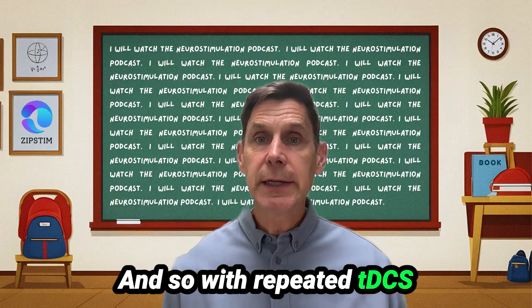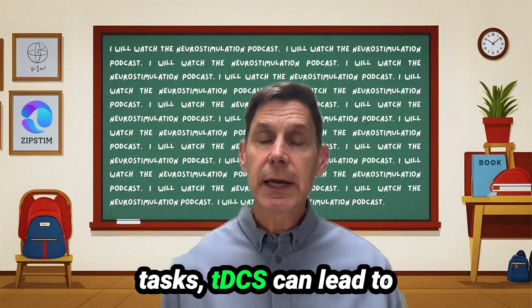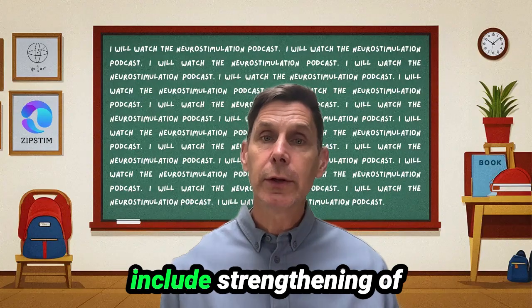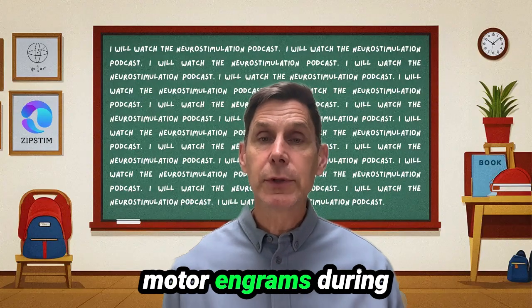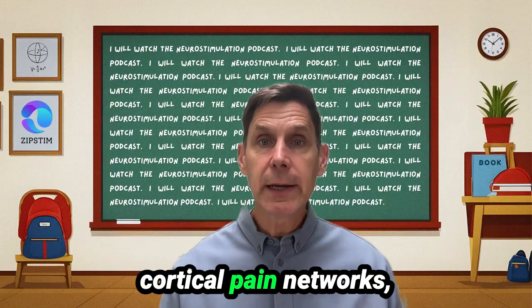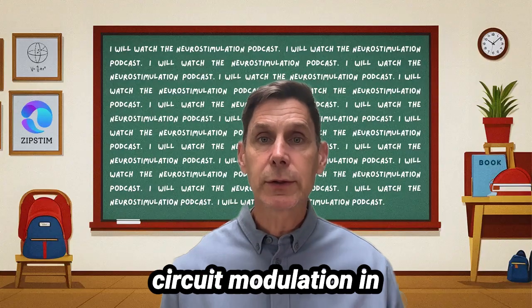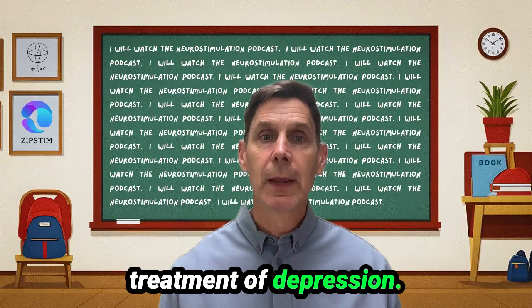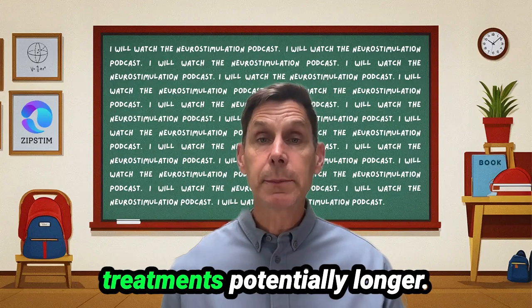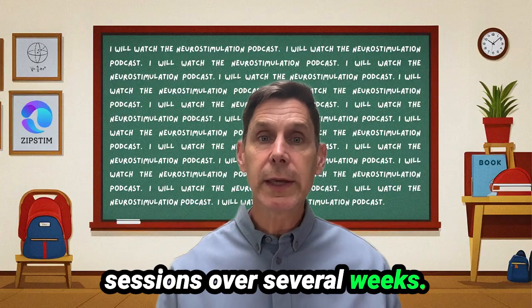And so with repeated tDCS sessions, and especially when paired with active tasks, tDCS can lead to lasting neuroplastic changes. Examples of these changes include strengthening of motor engrams during post-stroke rehabilitation, reduced hyperactivity in cortical pain networks, and improved emotional regulation by way of prefrontal limbic circuit modulation in treatment of depression. These kinds of after effects may last minutes to hours, and with repetitive treatments, potentially longer. This is why many clinical protocols involve daily sessions over several weeks.